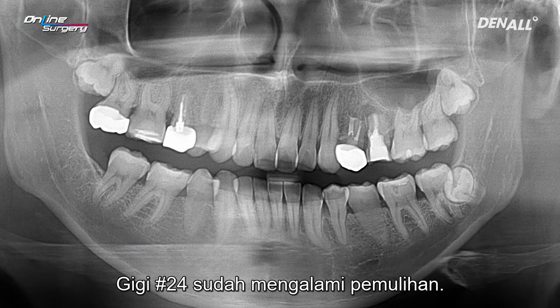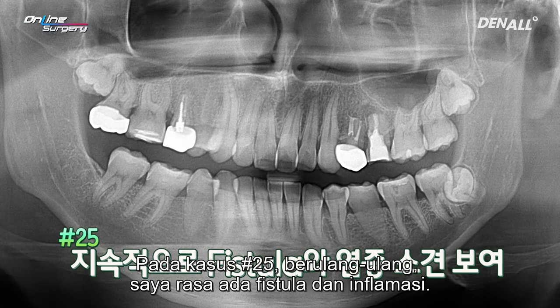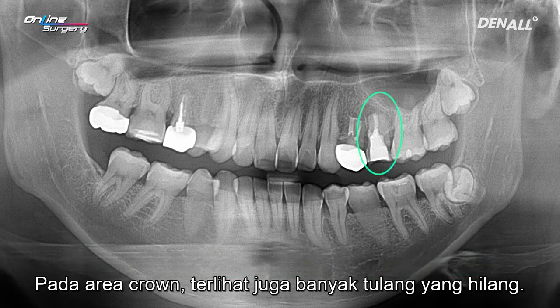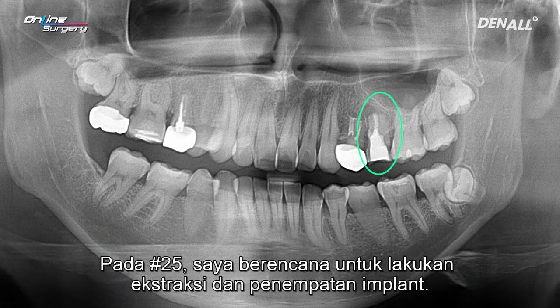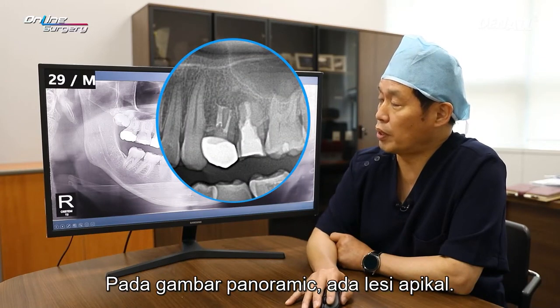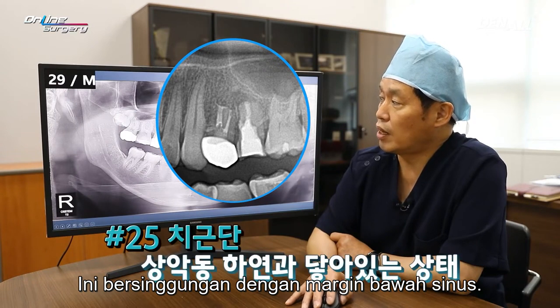Number 24 has healed nicely. In the case of number 25, repeatedly, I think there was fistula and inflammation. In the crown area, a lot of bone loss is observed. Number 25, I plan for extraction and implant placement. On panoramic image, there is apical lesion. It is in contact with the inferior margin of the sinus.